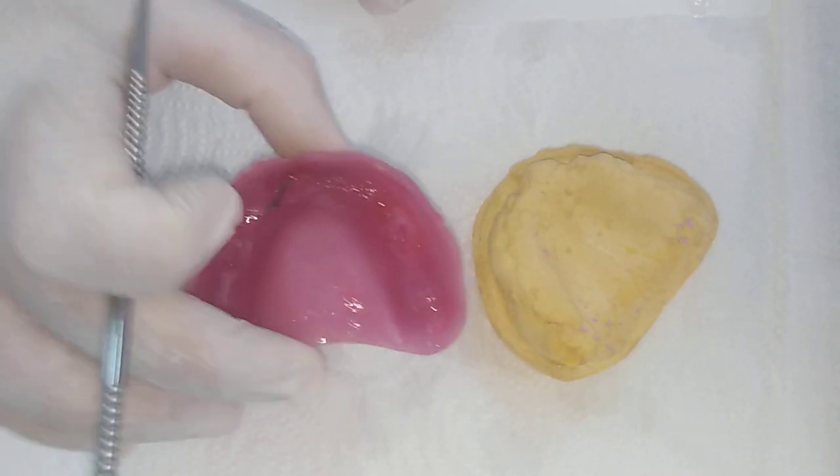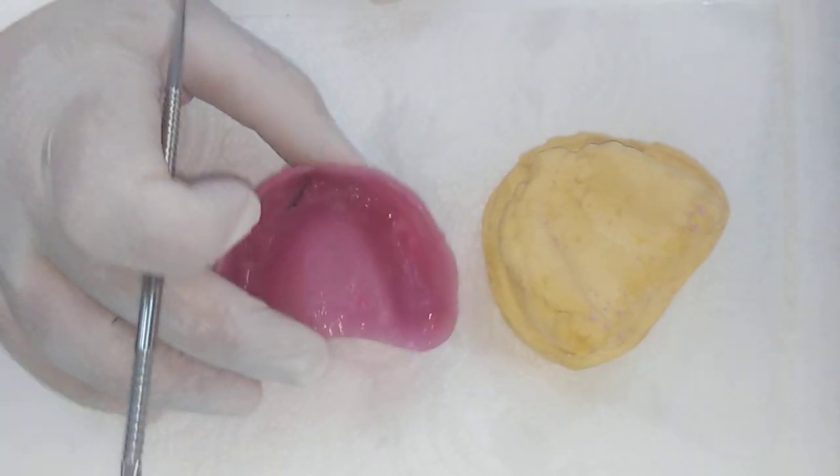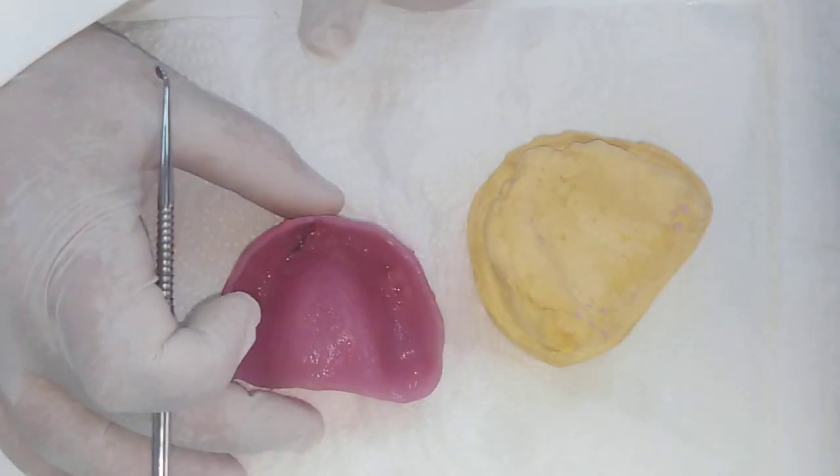A third reason is that this is heavy — it's not like the denture. The teeth on dentures are even lighter. But here we have wax and base plate, which is a heavy material. Add to that that this is the upper, so gravity is working against you.